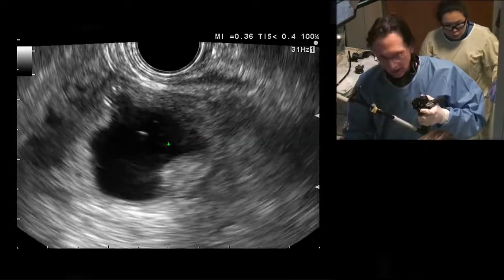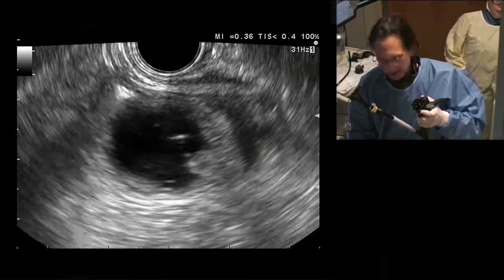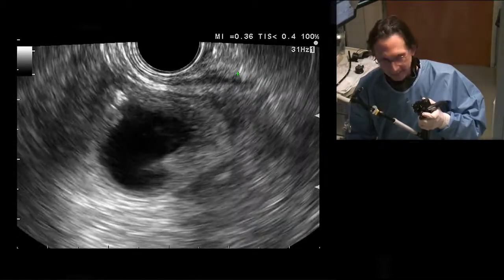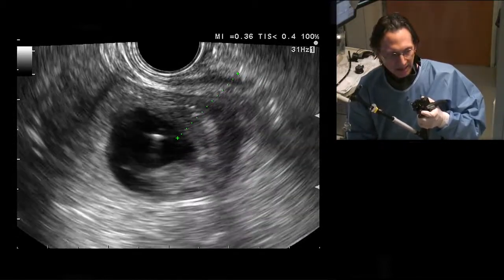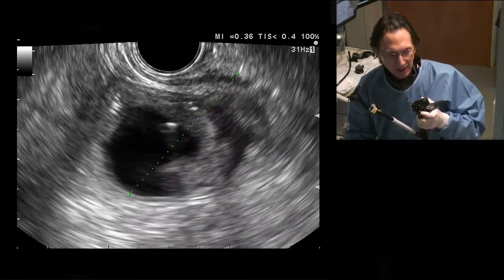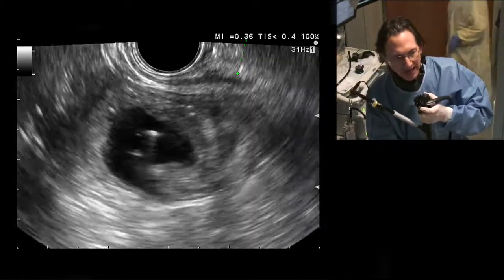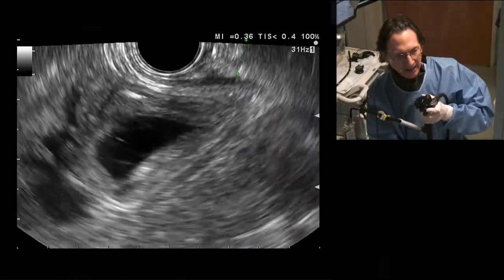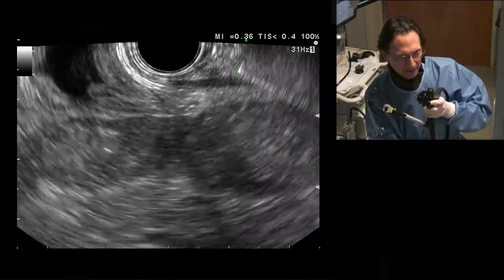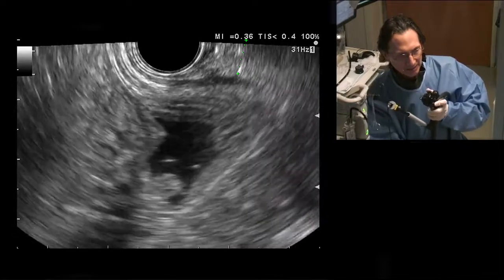So you can see that our distance would be, there's the tip of the AXIOS here. This is our target lumen. We can also measure this out just so that we have an idea of the distance. We're looking at about 1.5 centimeters to get in, but altogether, this is just shy of about 3 centimeters. I think if we push the stent out, we should still be okay. I still prefer this down here, but it's already starting to contract there as well. Let's stick with this.